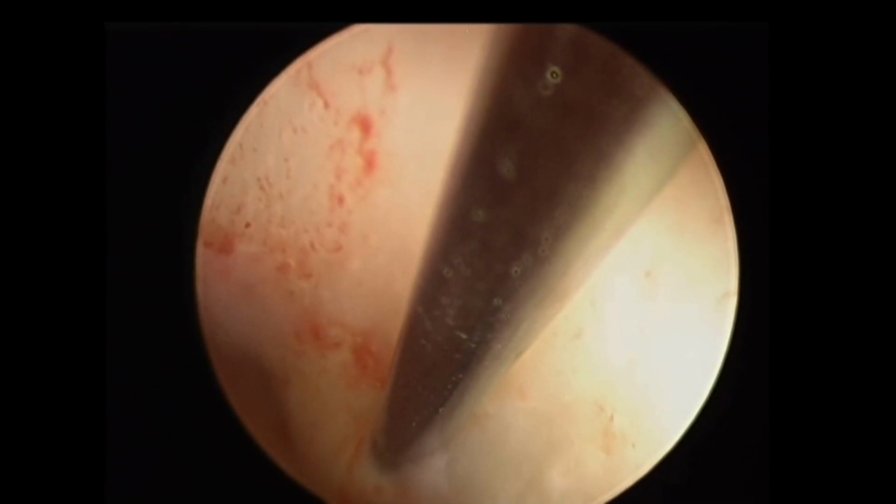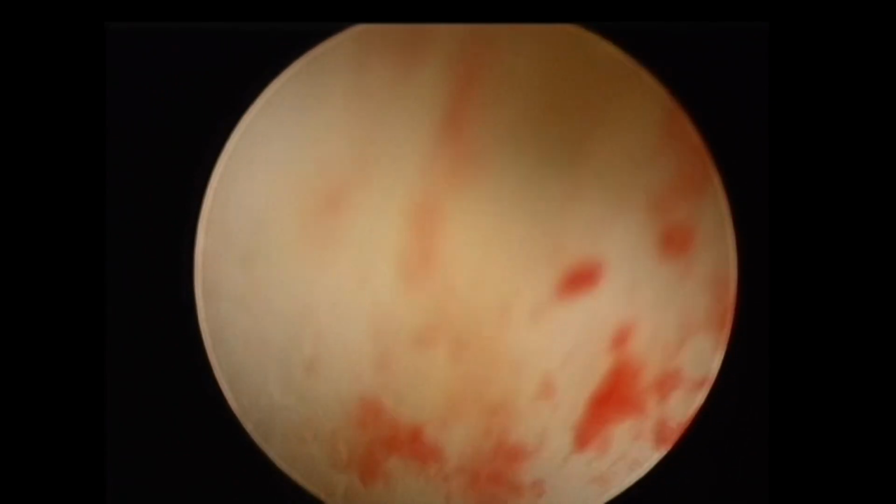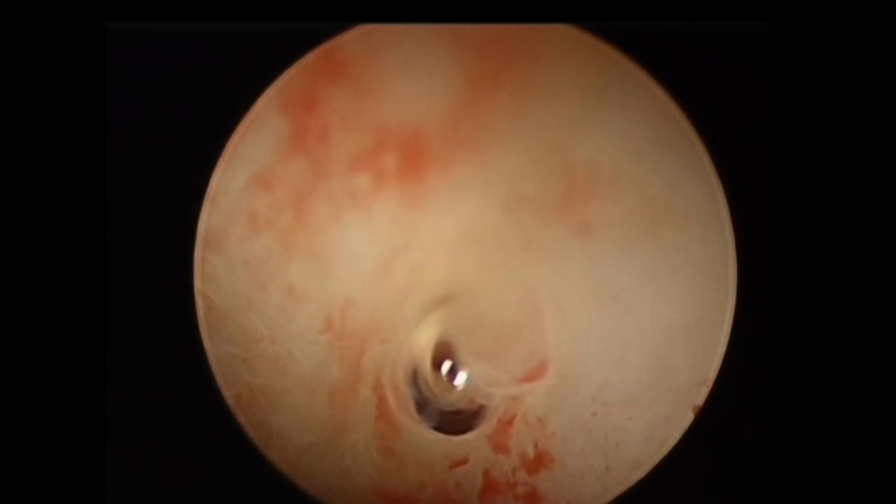The conventional PRP technique is to push it into the uterine cavity, same as IUI, as if flushing the uterine cavity with the platelet-rich plasma. But here, we inject the PRP underneath the endometrium.